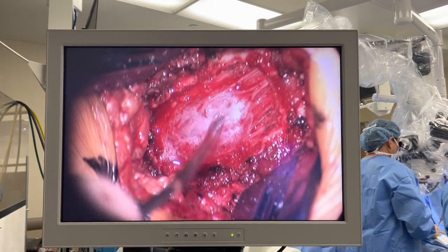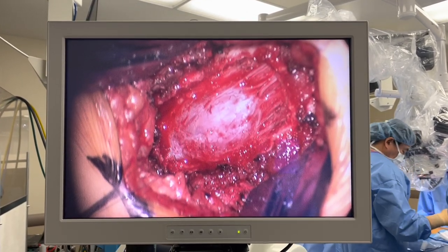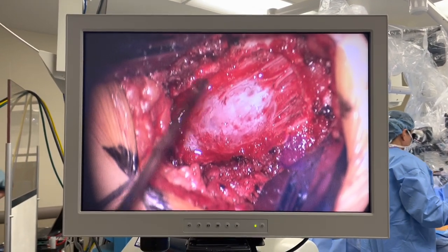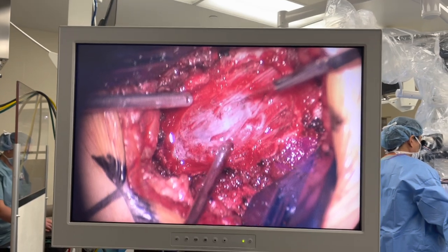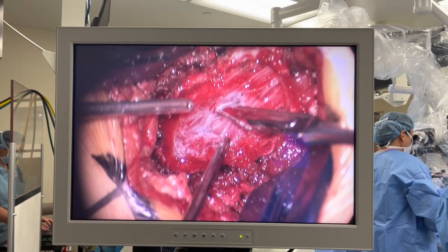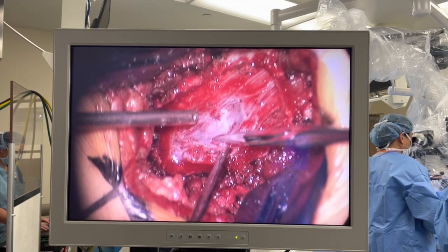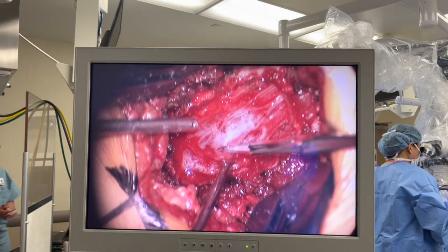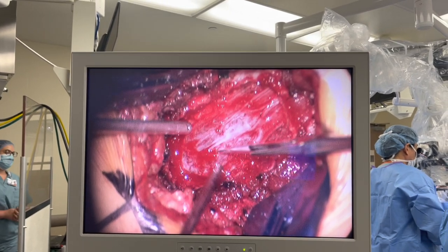There's an area right here where there's absolutely no nerves. I'm going to open it right there. 11 blade. Lucky us! So inside the dural tube, check this out. The first thing is, this should come pouring out. But look, there's these tiny little membranes that hold the water in. Spinal fluid. Here it comes.